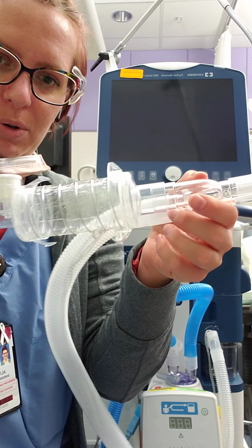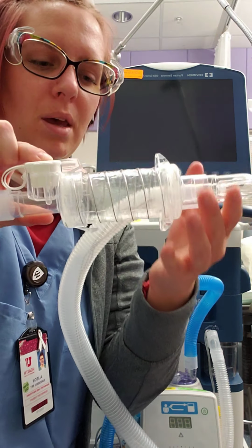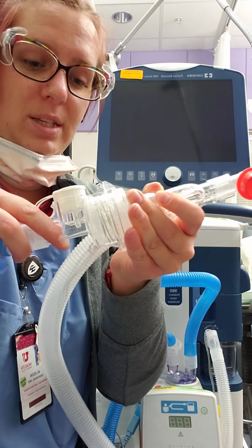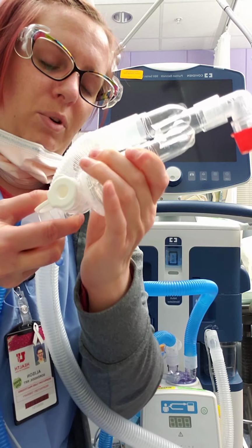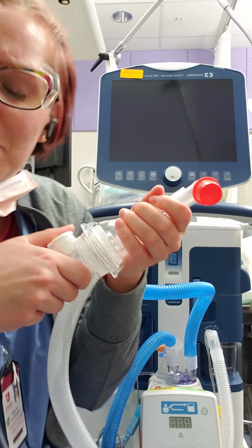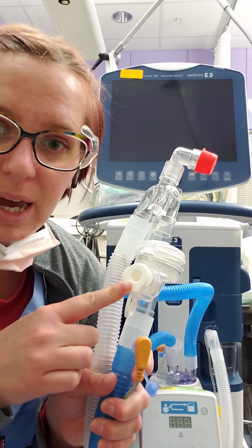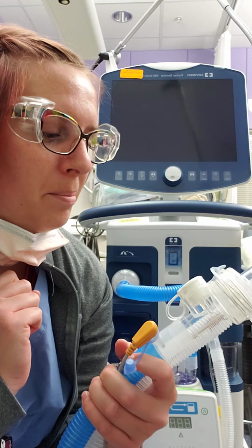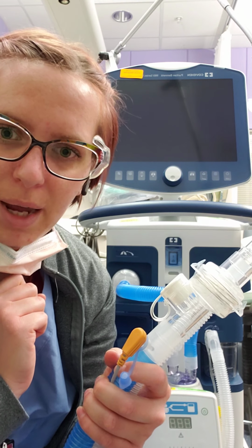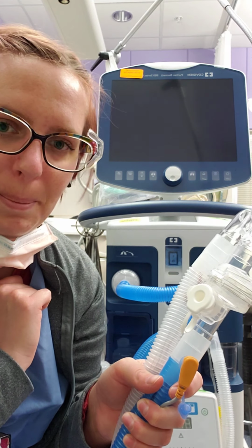So we have this on our inspiratory limb. We can administer our medication, and then we can collapse this to prevent rain out, dead space, and also just general space for your patient. This is so that we can administer an MDI without breaking the circuit every single time. So that's an inline MDI inhaler.